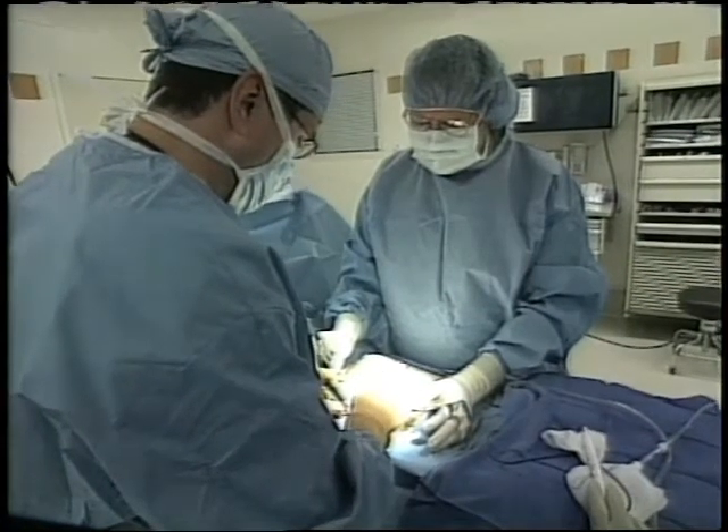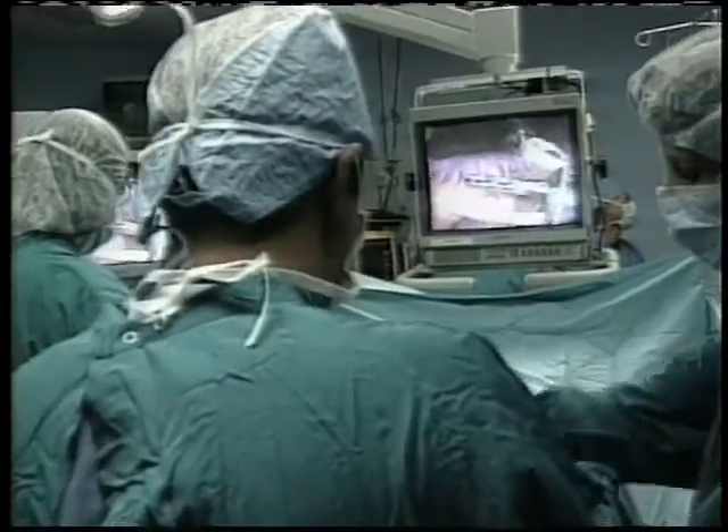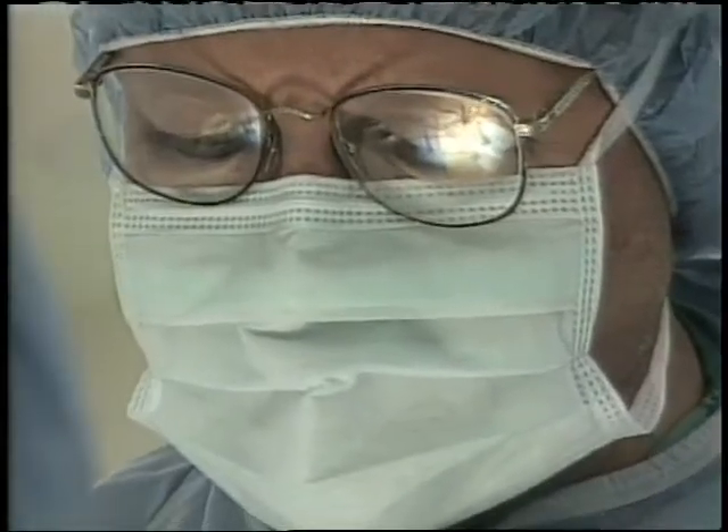The lap band system is done laparoscopically, and here you can see in this video laparoscopic instruments being inserted through rather small incisions, really no more larger than a buttonhole. Through those little tiny tubes, we can introduce laparoscopic instruments, and watching on a video monitor, we can do surgery through very small incisions, focusing in a very limited area.